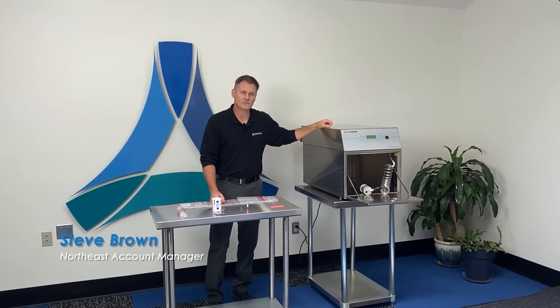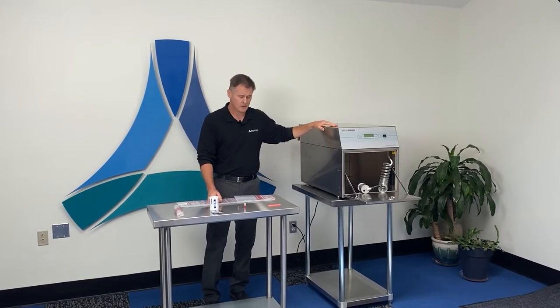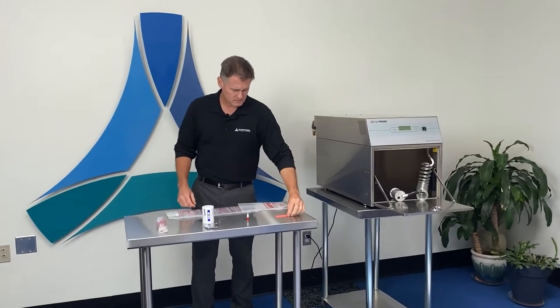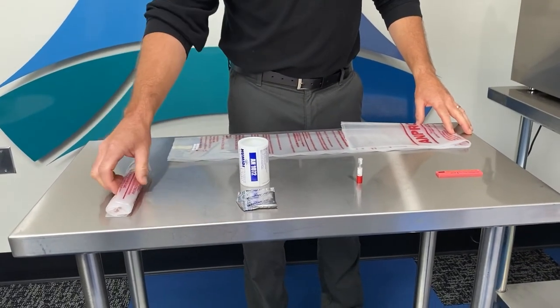Hi, my name is Steve Brown with Andersen Sterilizers. Today we're going to demonstrate how to load a cycle in the AN74J gas sterilizer using our sterilization liner bag, dosimeter, biological indicator, humiditube, humidichip, and our gas ampoule.